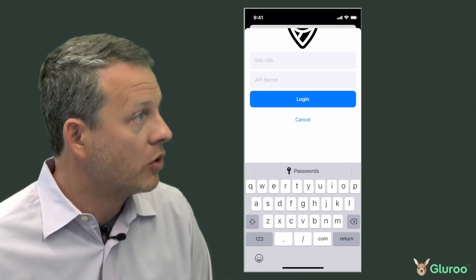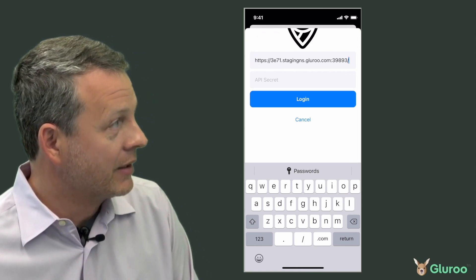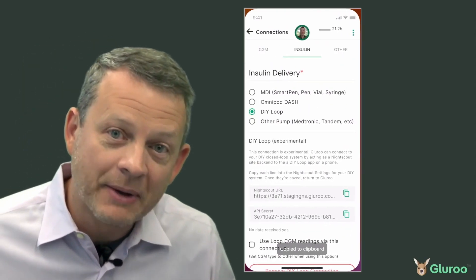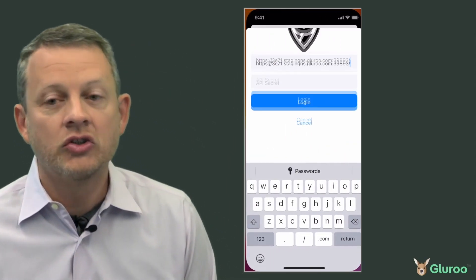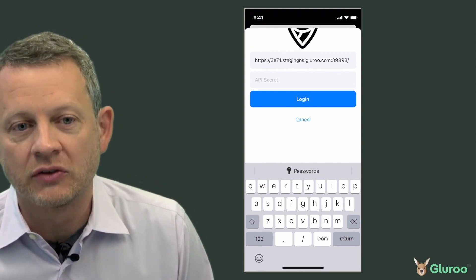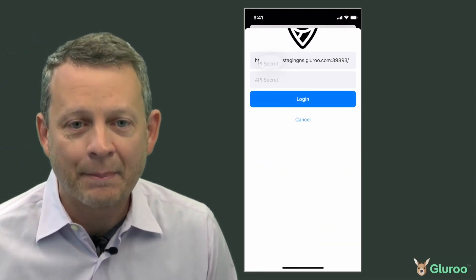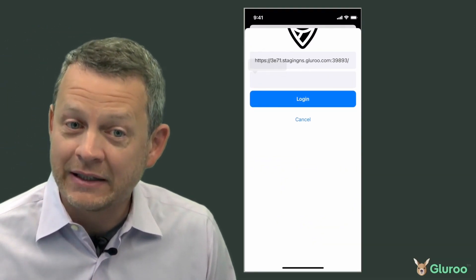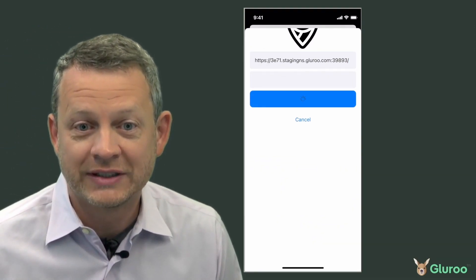When LOOP thinks it's writing to NightScout, it's actually making a direct connection to Gluroo's cloud service, so the updates happen immediately for all in the Gluroo crew to see.